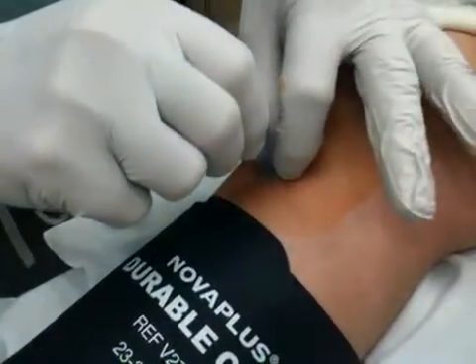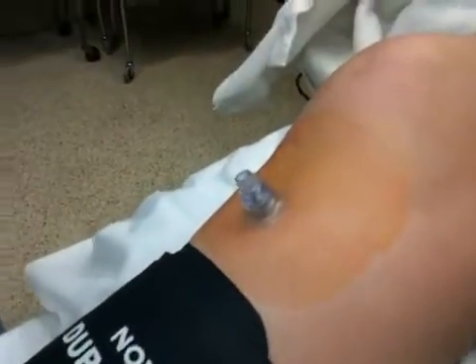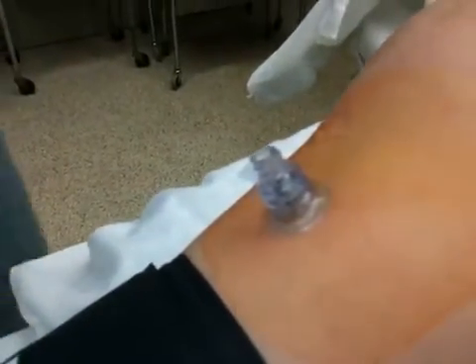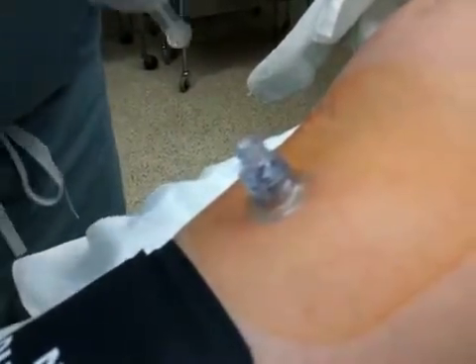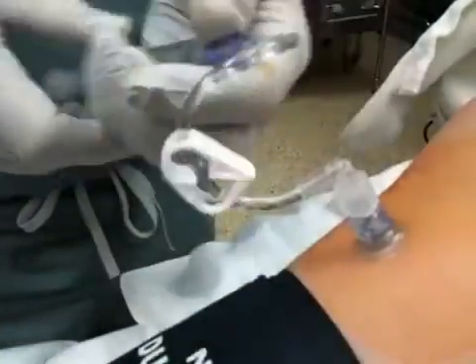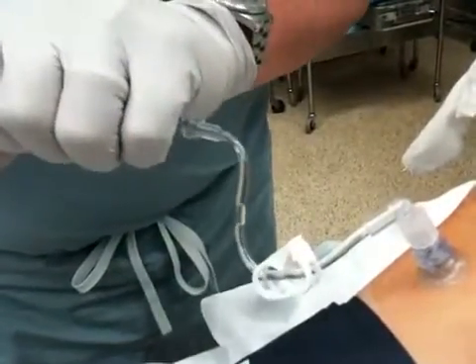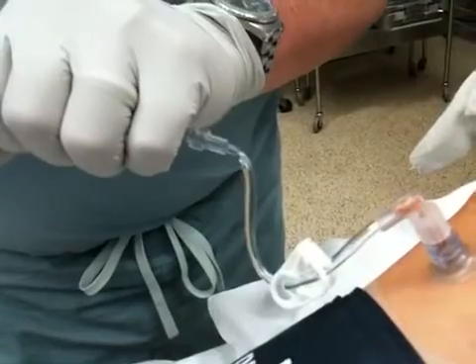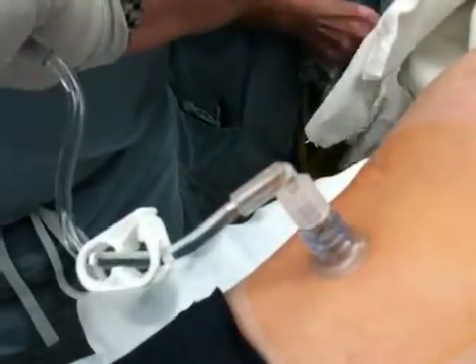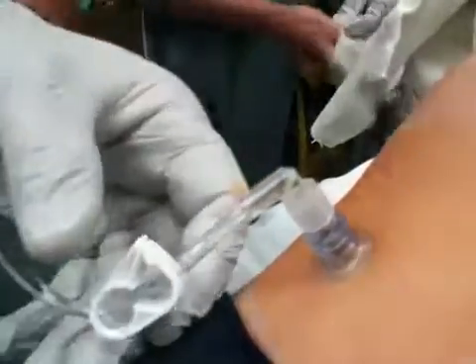I'm going to stabilize the bottom and screw the trocar out. We have an extension which has already been primed — I'm going to connect that on. Give it a vigorous 10 mil bolus to get things going. We'll try aspirating first. There is a bit of blood in the line. Vigorous bolus. And it's ready to use.